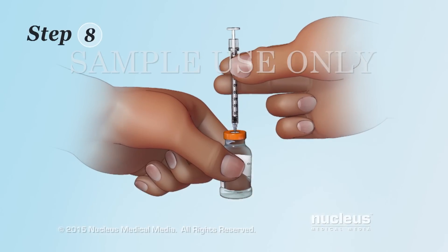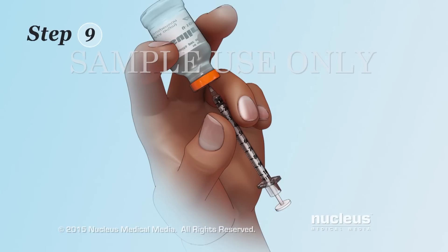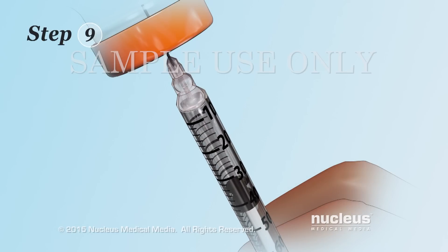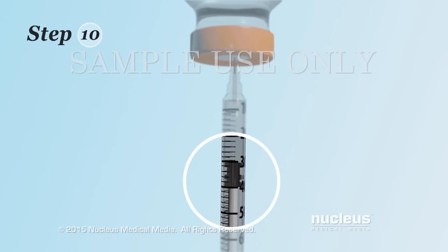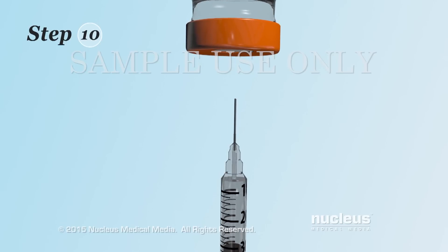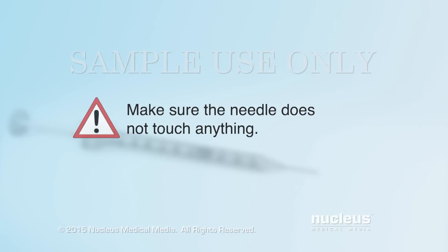Step 8: With the needle still in the bottle, turn the bottle and syringe upside down. Step 9: Pull back the plunger to fill the syringe with just a little more than the insulin dose you need. If you see air bubbles, tap the barrel of the syringe with your finger to make them rise to the top. Slowly push in the plunger just enough to push out the air and extra insulin. Step 10: Carefully check to make sure the amount of insulin in the syringe matches your insulin dose. Pull the needle out of the bottle and carefully lay the syringe on a flat, clean surface. Make sure the needle does not touch anything.